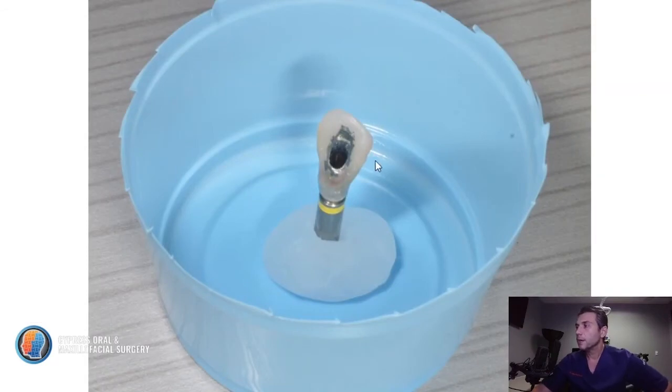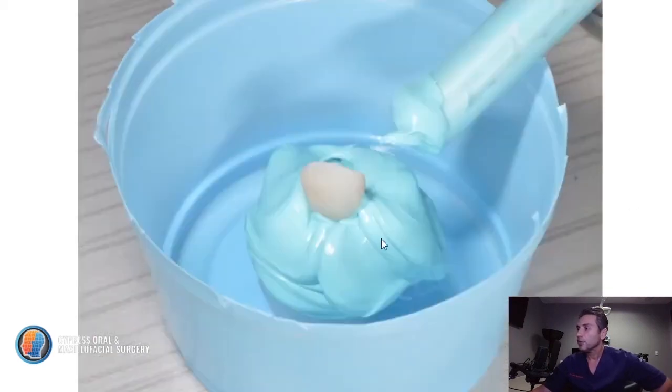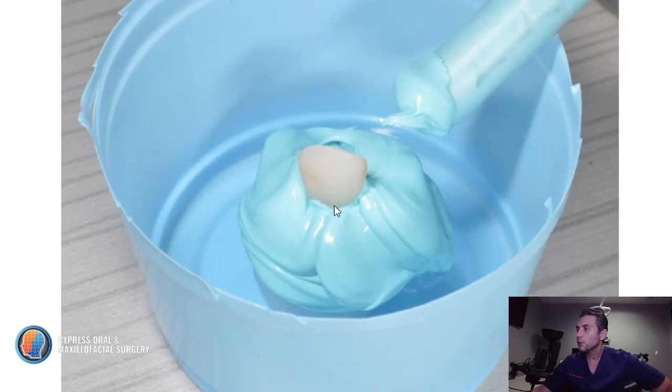So we take this impression coping and the temporary tooth complex, is what I call it, and we put it in a little bit of wax in a paper or plastic cup. And then we actually take an impression of the bottom of the temporary. You want to make sure you fill this up all the way and make sure you don't have any bubbles past the dentogingival junction. So I'll go a few millimeters past that.